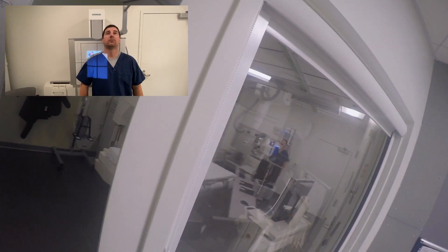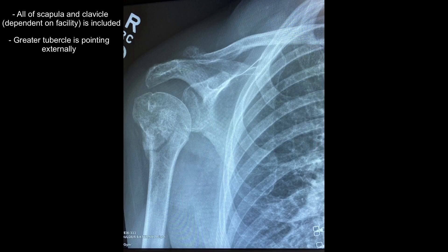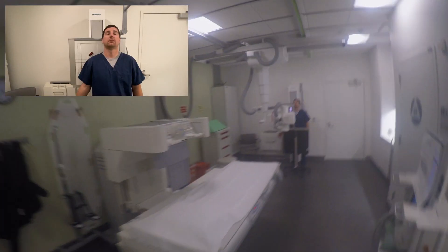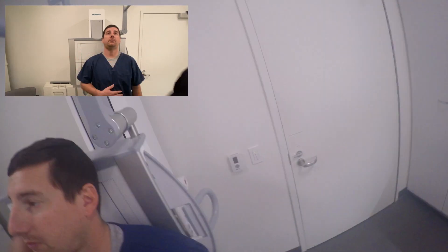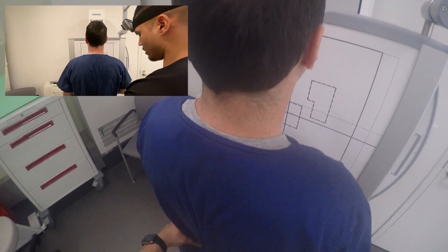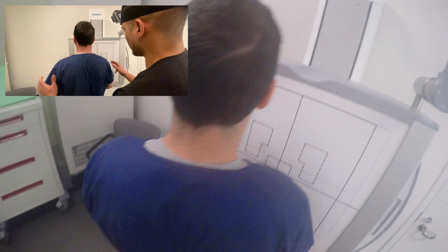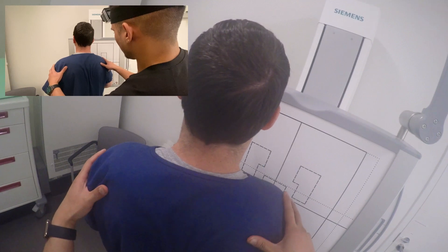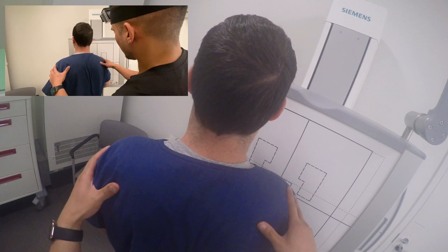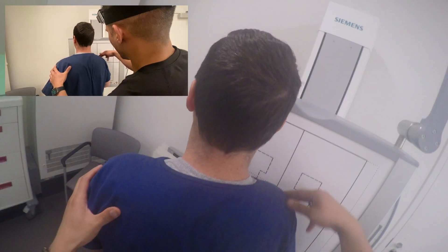Go ahead and rotate your palm forward. Go ahead and put your hand on your stomach. And then we're going to turn around and face the board. And then we're going to rotate you a little bit more. Move your feet with you. There you go. I then tell my patient to turn and face the board, then proceed to get him in the angle of my liking — turning my patient from the hips and telling him to move his feet with him. Reason being, if I just move his upper half, it will begin to return to the starting position, causing rotation and a potential repeat.